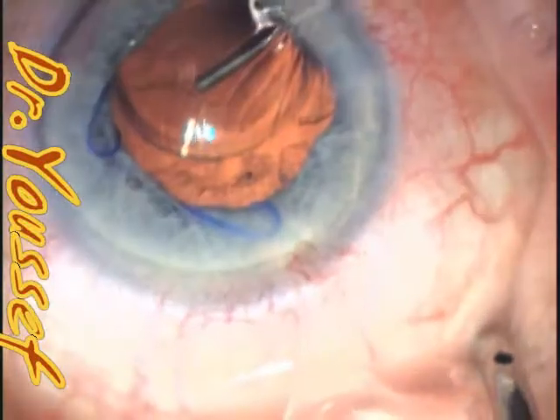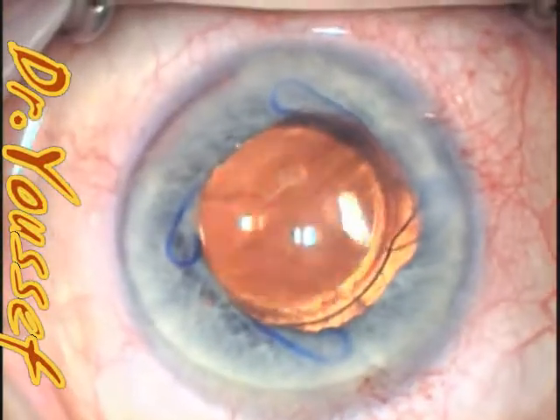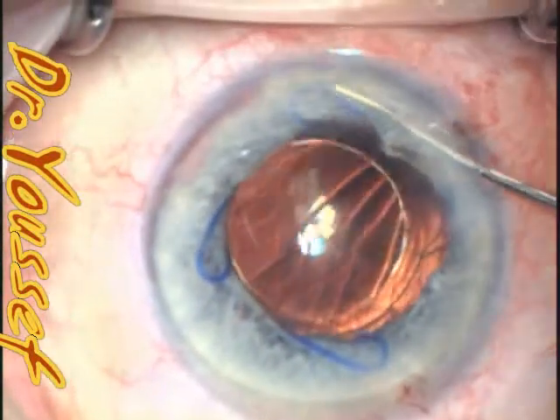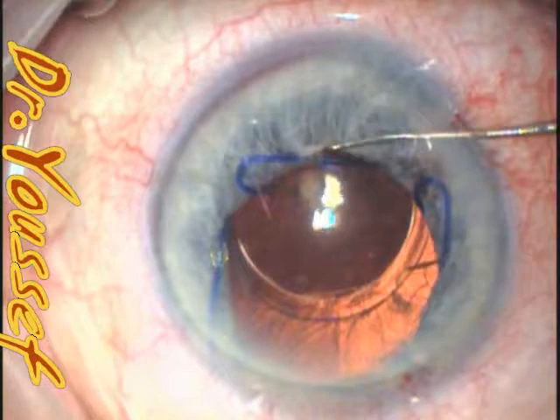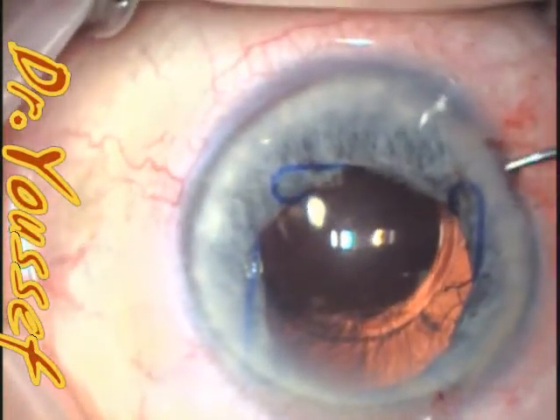Making sure the position is okay. I'm trying to test the lens, make sure it's in good position and it's stable enough. Here I'm going to take out the Malyugin ring. I start by dislodging the upper one first. You can see that the iris is very, very floppy.